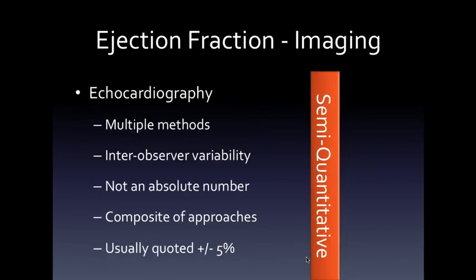And everything we do in echo is to try and make an estimate, make some sort of measurement without using the extraordinary lengths you actually have to go to measure actual ejection fraction in the physiological model. So for that reason, there are multiple methods. For sure, there's marked inter-observer variability, and that's where I think the repetition, the looking at the normals, has to be done.